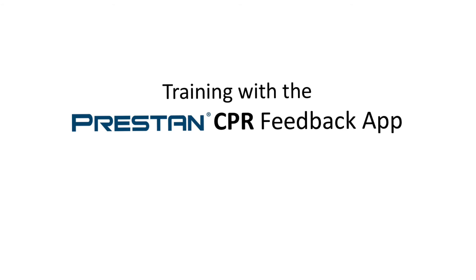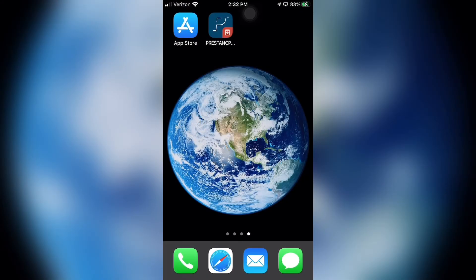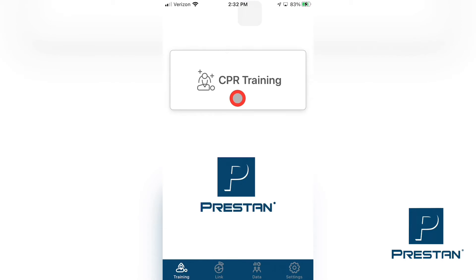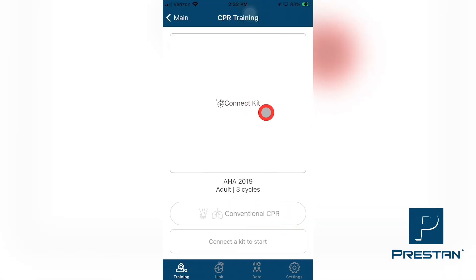Training with the Preston CPR Feedback App. To start your CPR training session, first ensure that a ventilation lung bag has been installed into your Preston Professional Adult Series 2000 mannequin in accordance with your instruction manual and is connected to the ventilation sensor at the port provided on the ventilation lung bag. On your smart device, make sure that the Training tab at the bottom of the Preston CPR Feedback App screen has been selected. The opening screen will show a button with the words CPR Training. Tap on this button to start connecting to your selected mannequins. On the next screen, select Connect Kit.